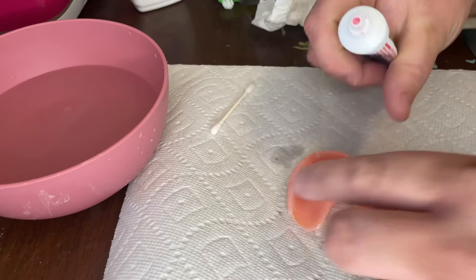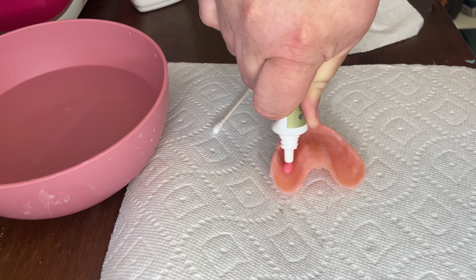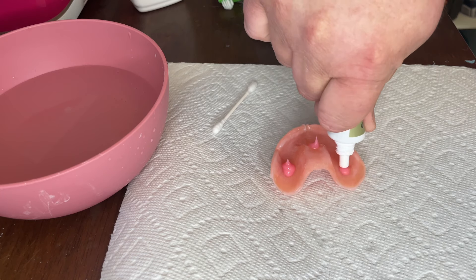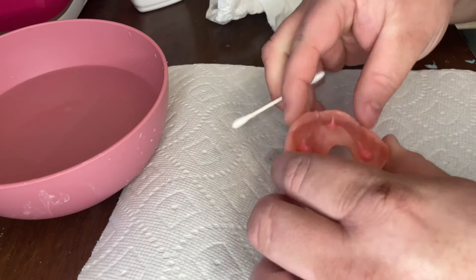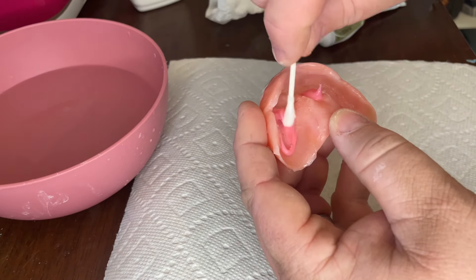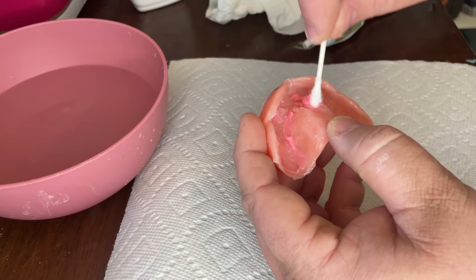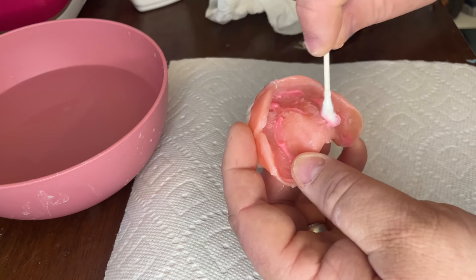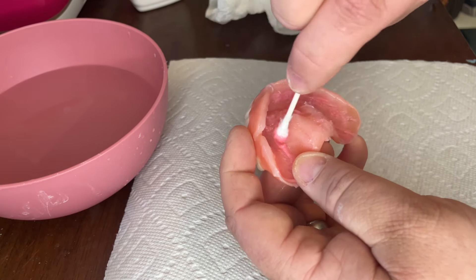Now I'll grab my Fixin' It Paste. For the upper denture, I apply three drops of adhesive — one on the side, one in the middle of the palate, and one on the other side. I'll use a q-tip to evenly spread it out. You want to make sure the entire denture is covered with a thin, even coat of paste adhesive, getting up the wall of the denture and over the palate.